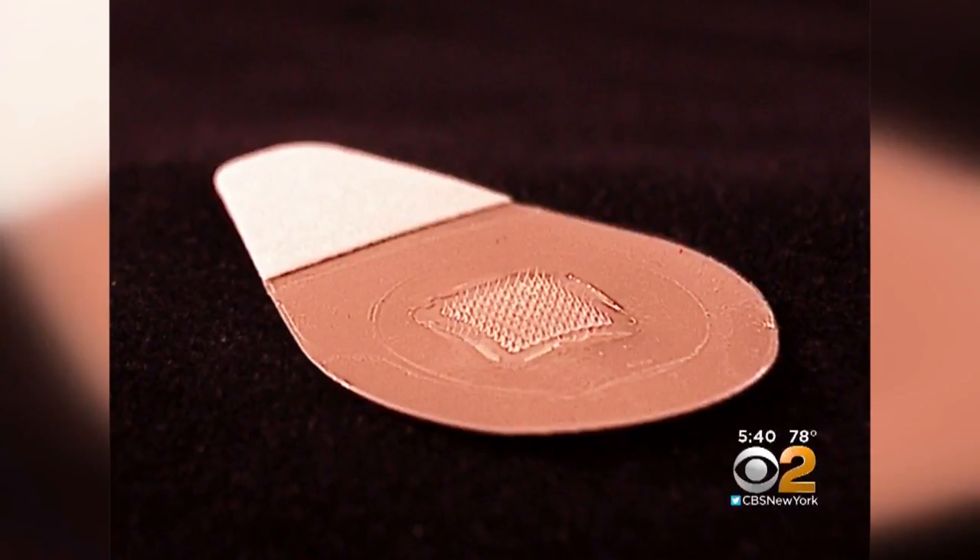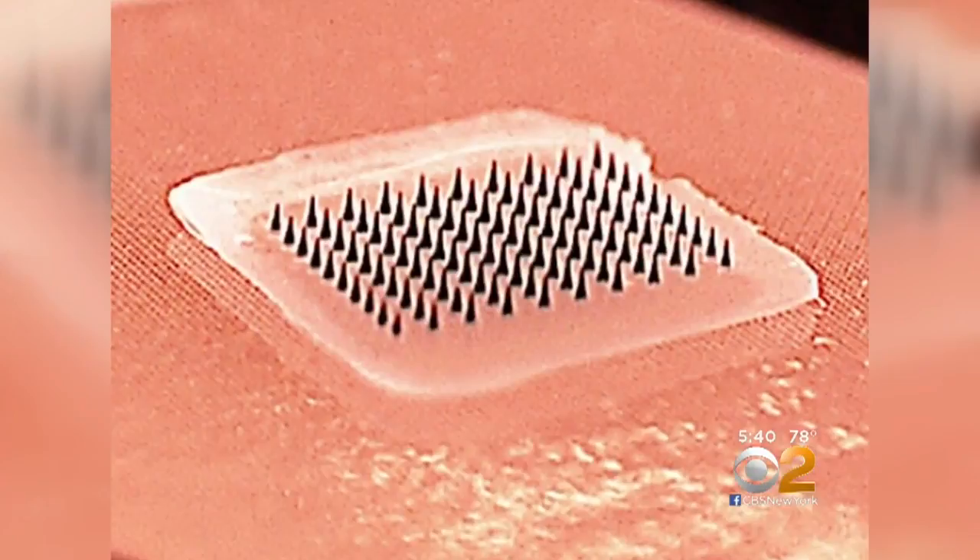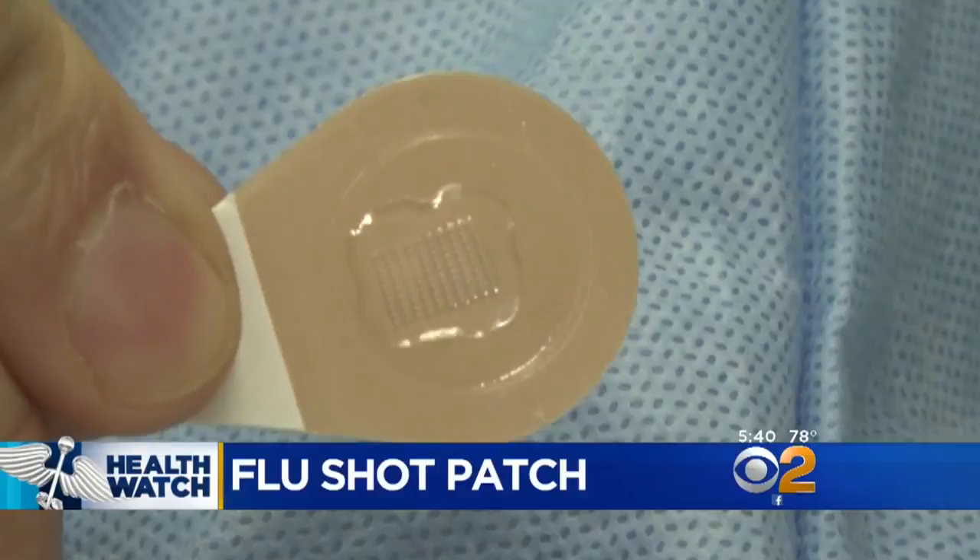This skin patch could change the way some people get their annual flu vaccine. The band-aid-like patch sports 100 microscopic needles loaded with dried flu vaccine. They actually dissolve over about 20 minutes, releasing the inactivated flu virus.